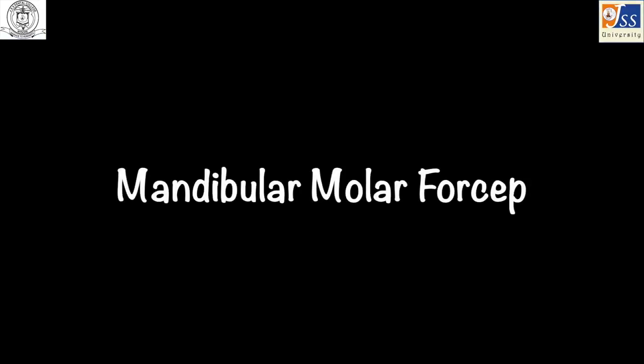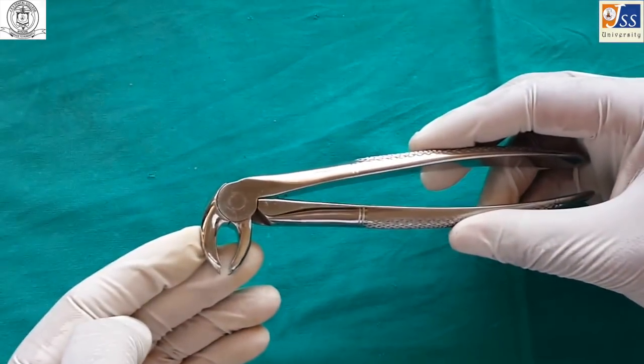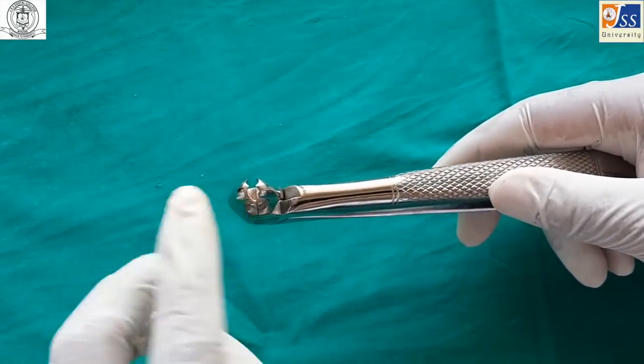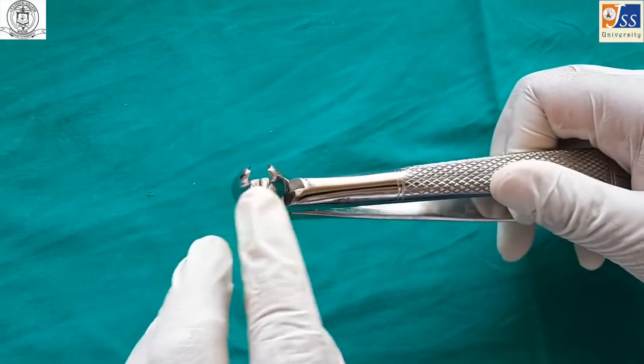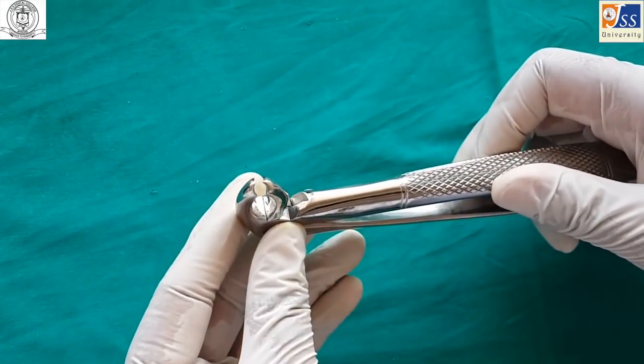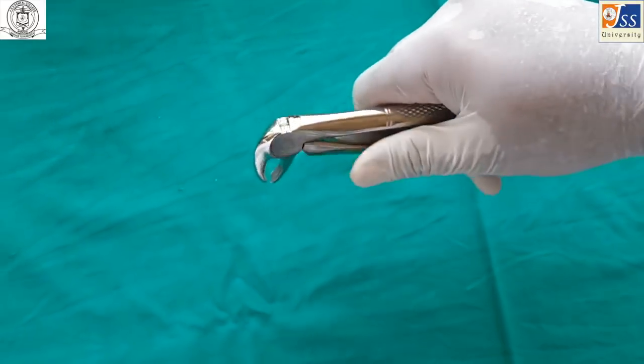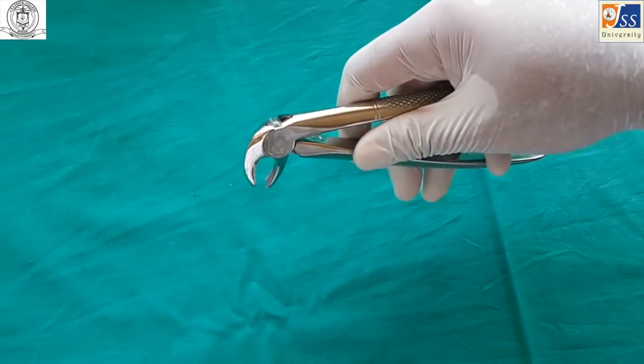The mandibular molar forceps is used for the extraction of mandibular molars. Both beaks have a sharp projection which engages the furcation area. Unlike the maxillary counterpart, this is a single instrument which can be used for both sides.